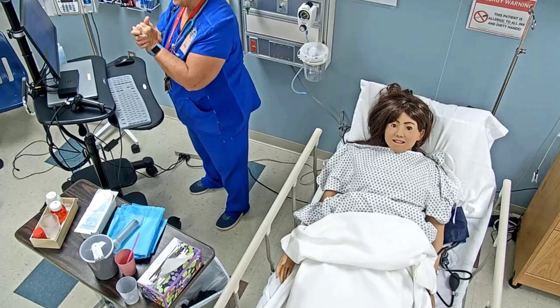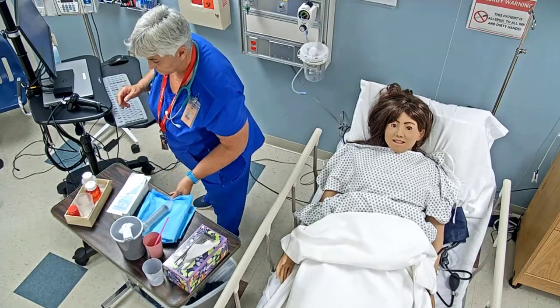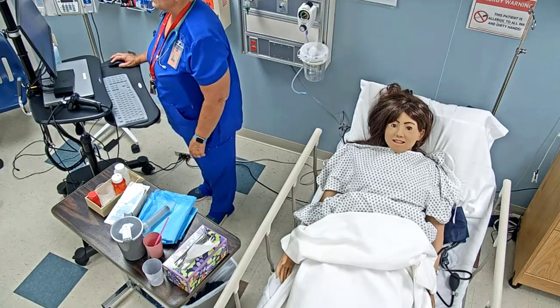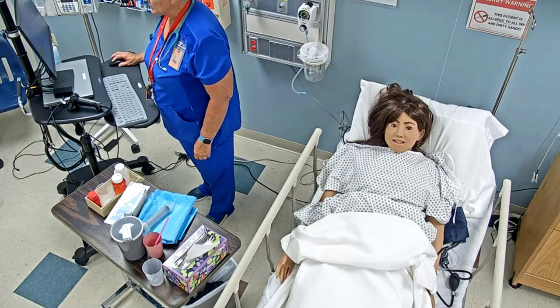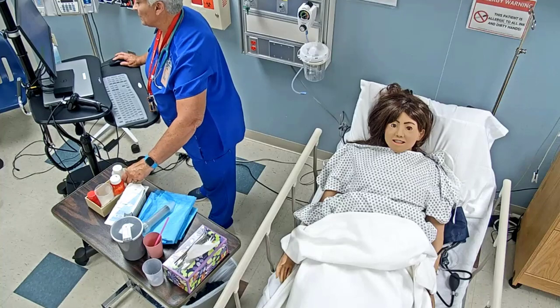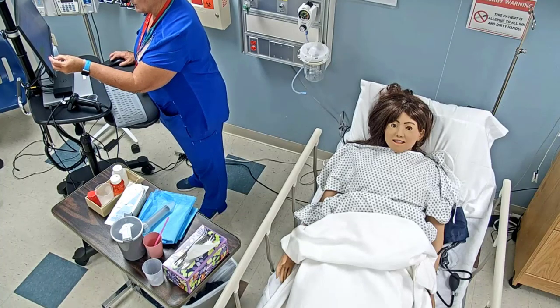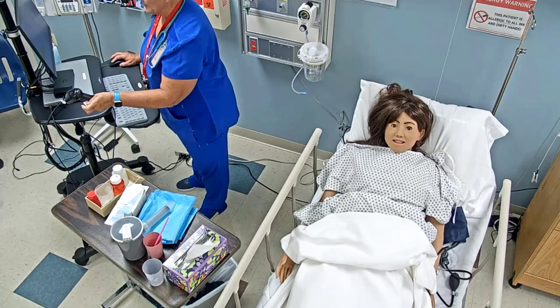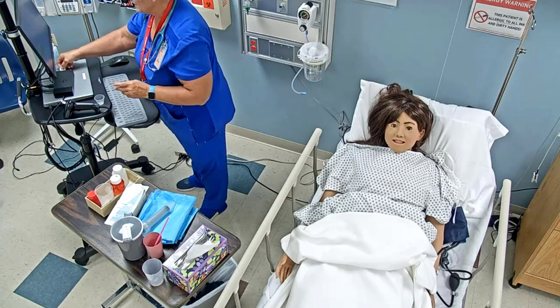Okay, so now we're going to go ahead and do our third check with our patient with our medications. So I have Anna Taylor, date of birth 4/24/1991. My scanner. We have no known drug allergies. Metoprolol 100 milligrams daily per PEG tube at 9 o'clock. And so in my hand, I have metoprolol. It's 100 milligrams. Expiration 2/20/25, and it's intact, so it's good. So I'm going to go ahead and scan my medication. Okay, so that's my third check.